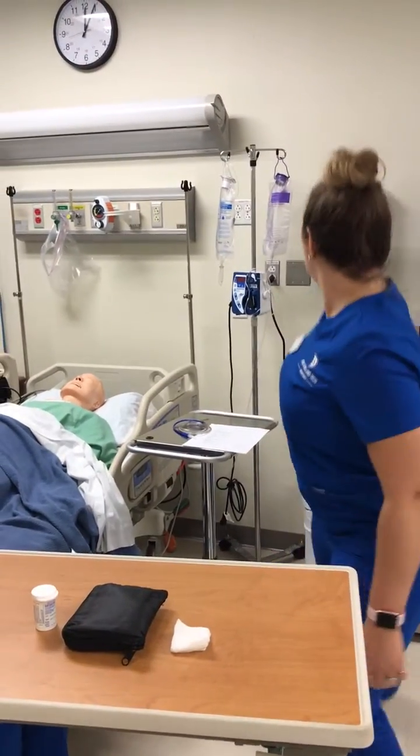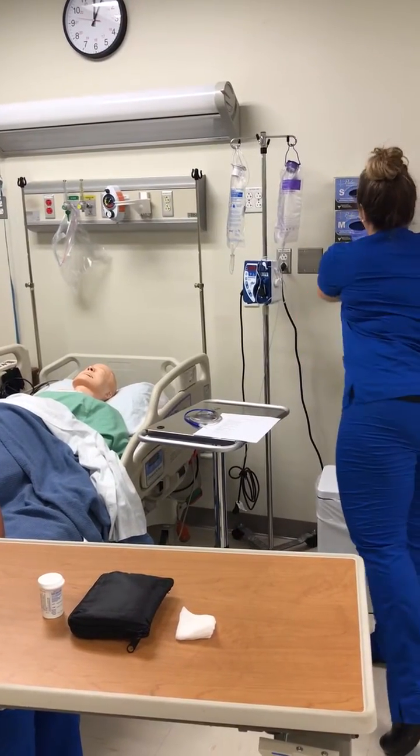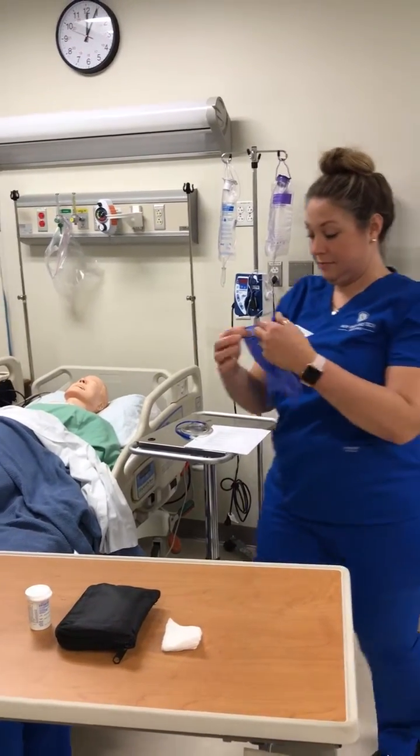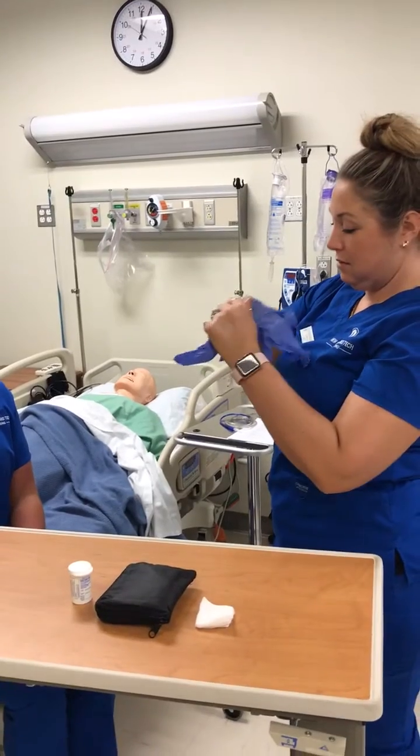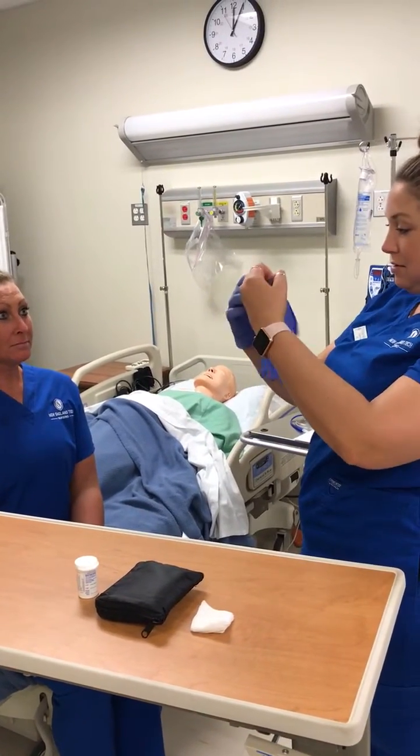First, I'll perform hand hygiene and don gloves. Are you in any pain today? No.